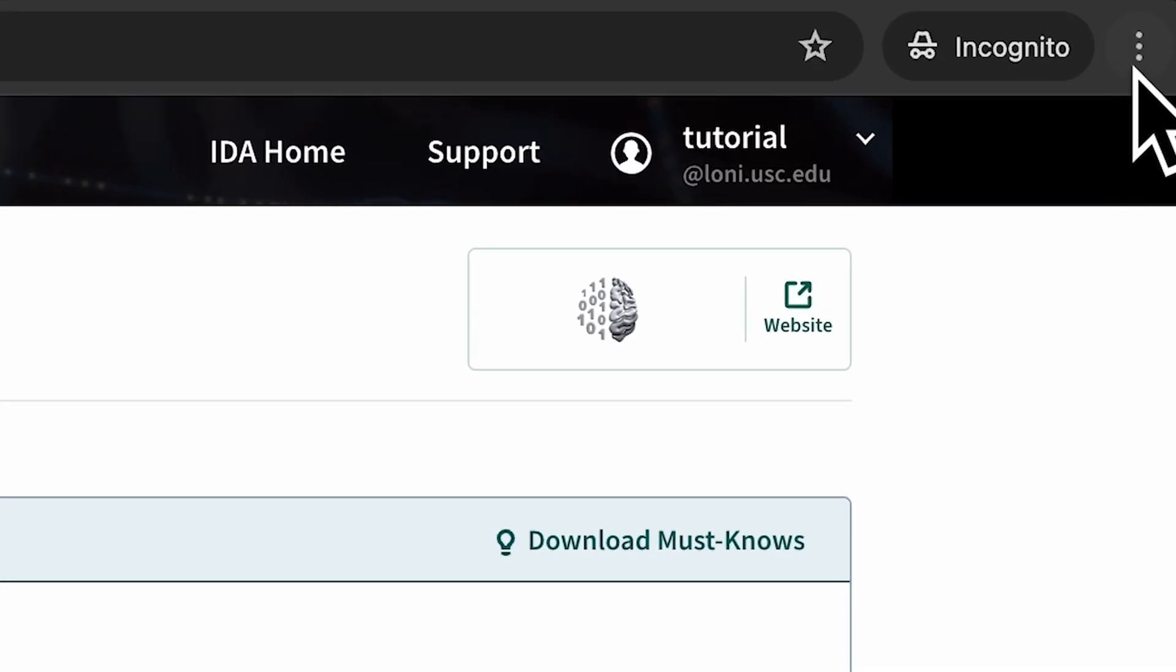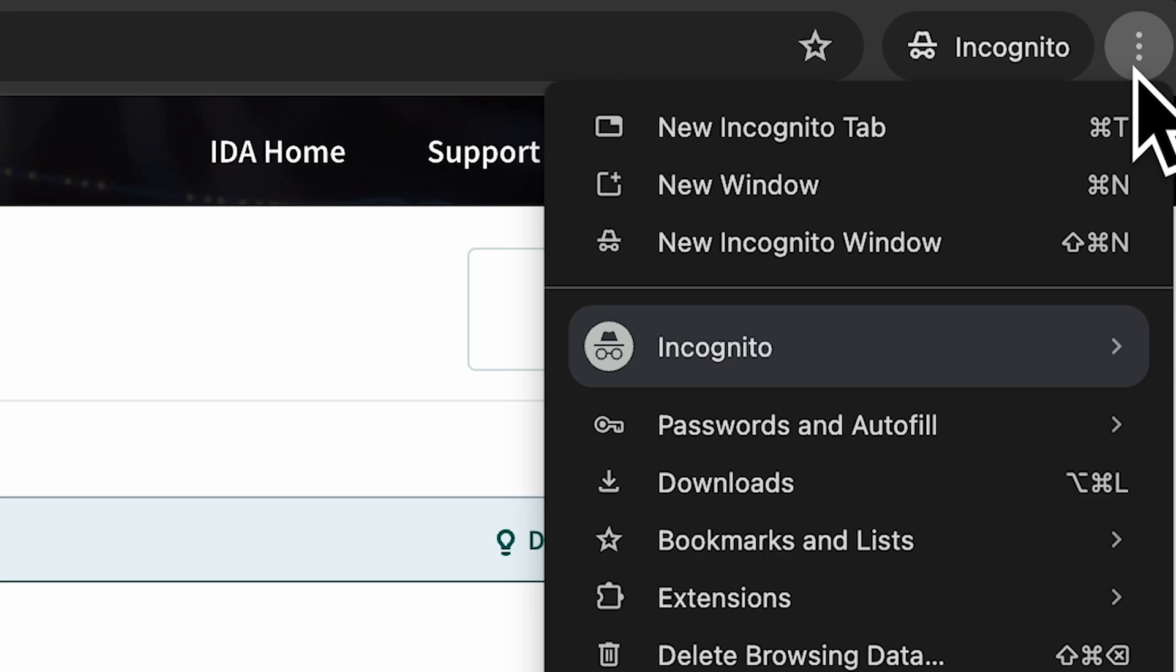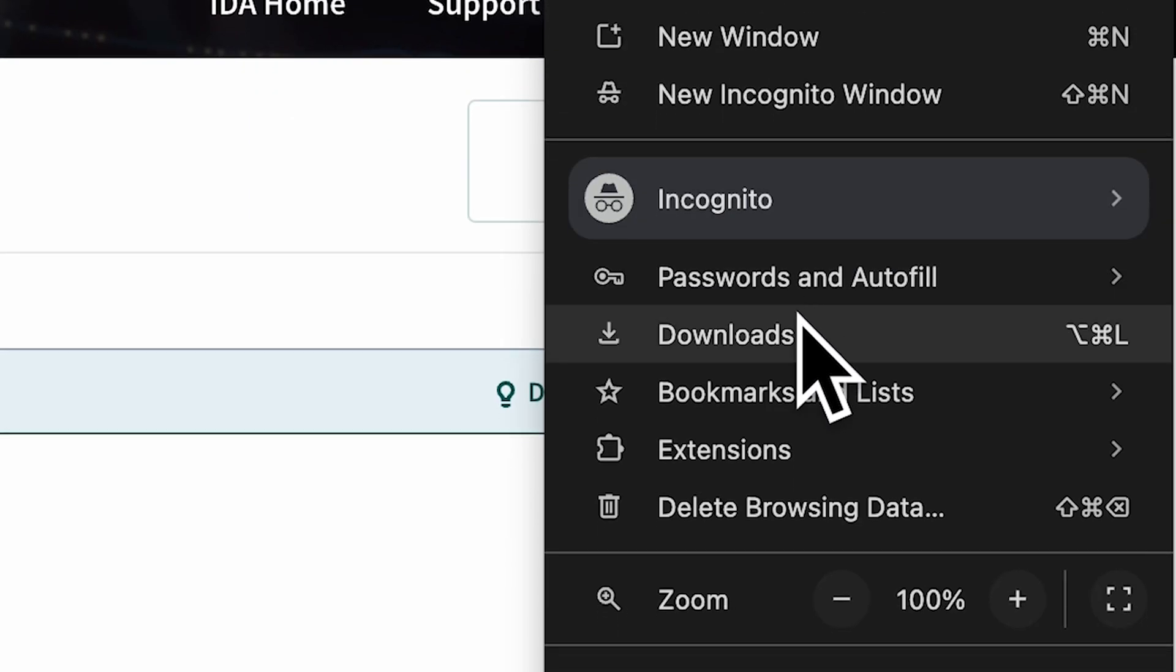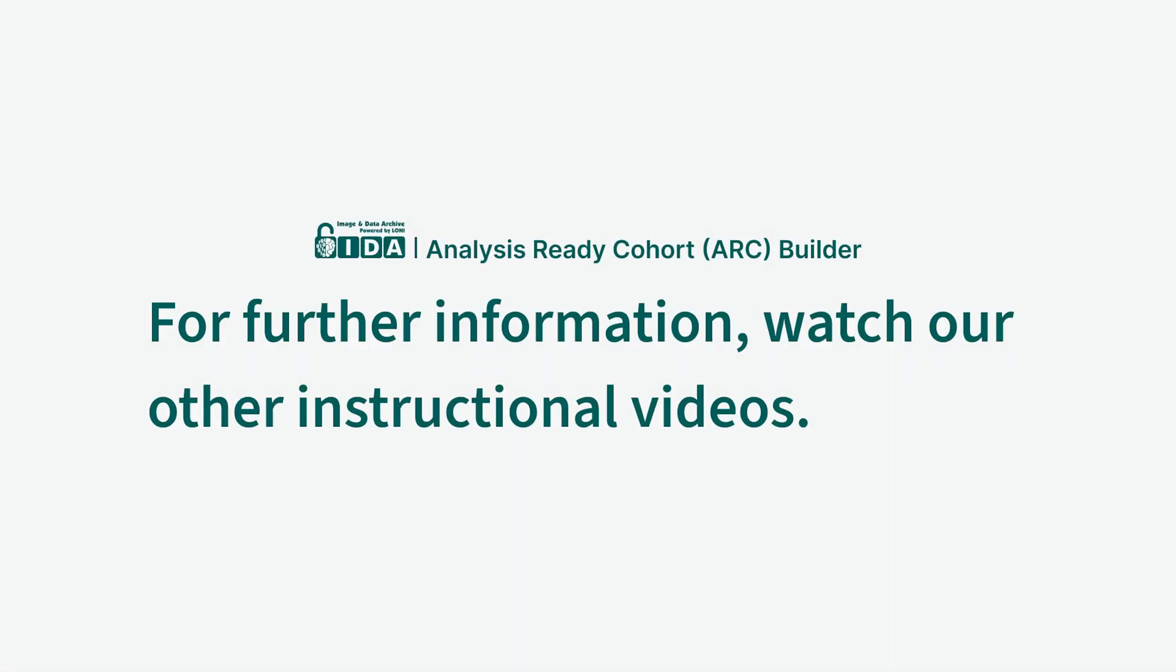You can monitor the download progress in the browser's Downloads panel. For further information, watch our other instructional videos.